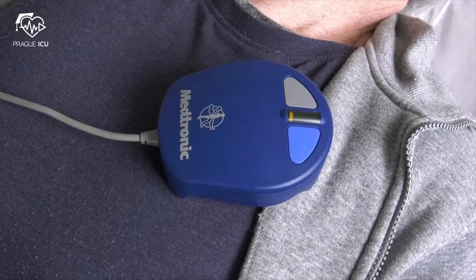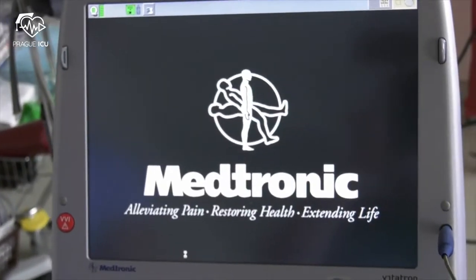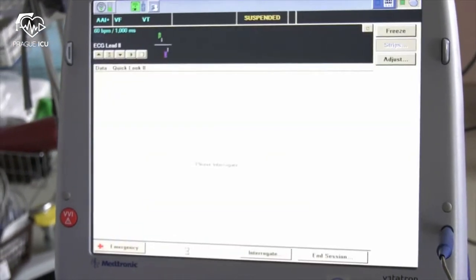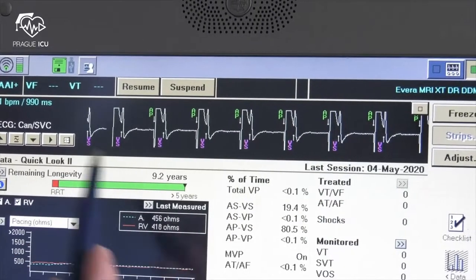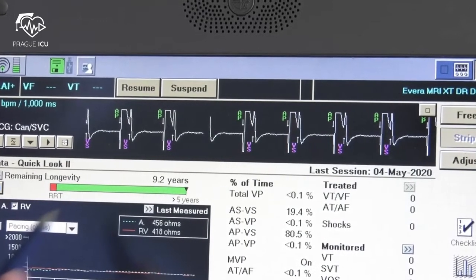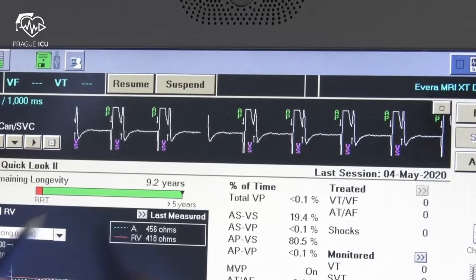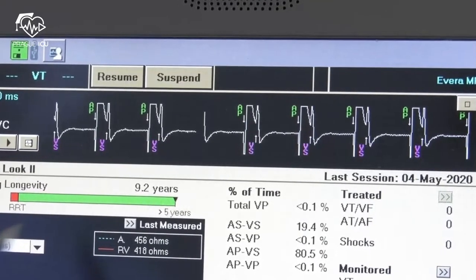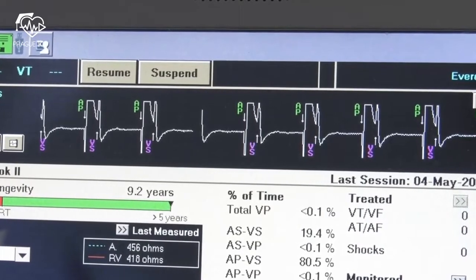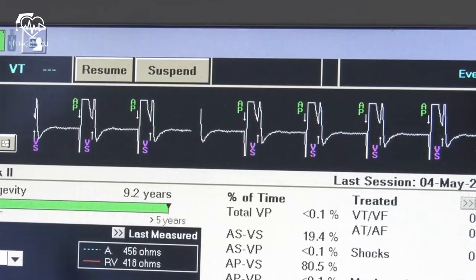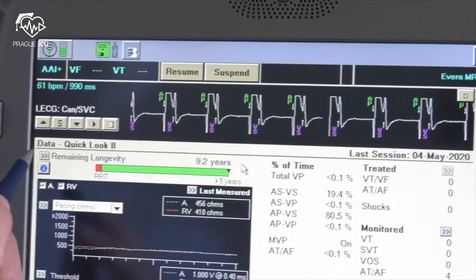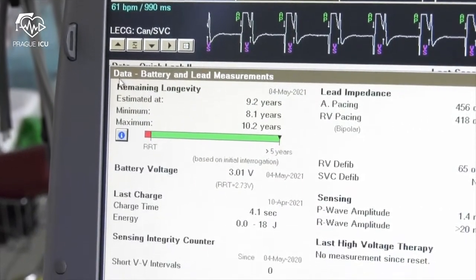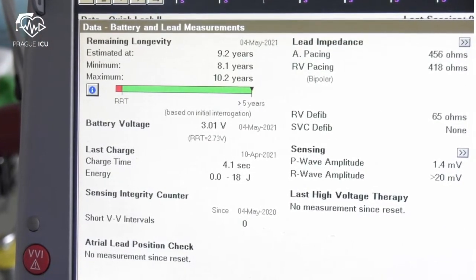Start interrogation by placing the programming head over the device. After establishing connection you'll be able to see various basic data on the home screen. Assess the patient's rhythm at the top of the screen in a live EGM display. In this patient you can see atrial pacing with AP marker with intrinsic conduction to ventricles and VS ventricle sensing marker. In the left upper part of the screen you can see remaining device longevity, estimating battery life for 9.2 years. Click on the double arrow to see more details about battery longevity, then you can print measured data by clicking on the print button in the lower right part of the screen.